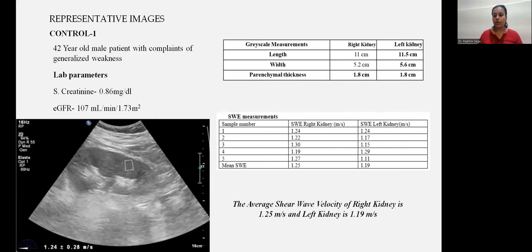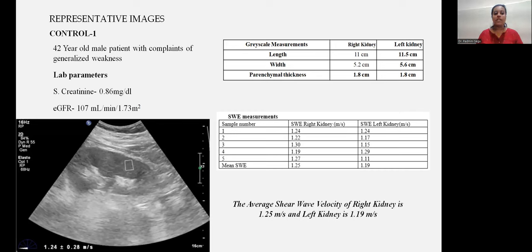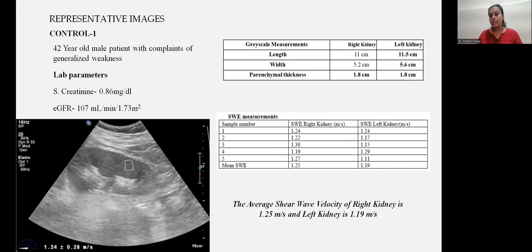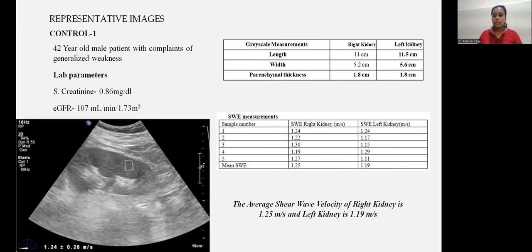Here are representative images of cases and controls. Control one: a 42-year-old male with generalized weakness. Serum creatinine 0.86 mg/dL, eGFR 107 ml/min/1.73 m². Right kidney length 11 cm, width 5.2 cm, parenchymal thickness 1.8 cm. Left kidney 11.5 cm, width 5.6 cm, parenchymal thickness 1.8 cm. Mean shear wave velocity was 1.25 m/s in the right kidney and 1.19 m/s in the left kidney.